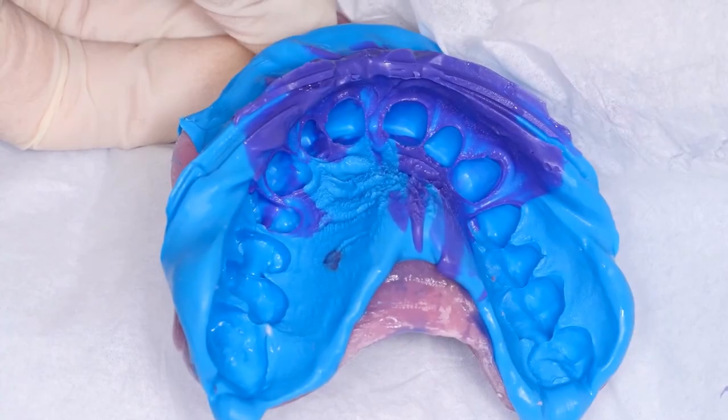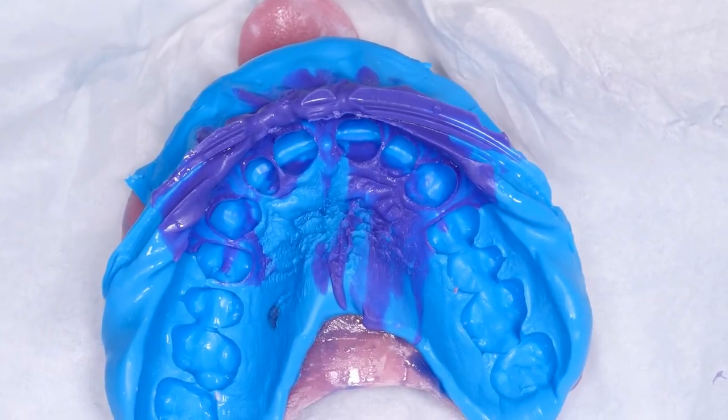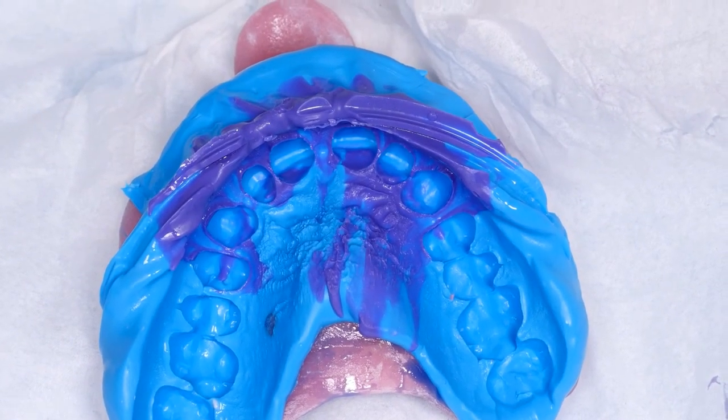Dr. Fredani, can you see the buckle? Maybe with the color, you see a bit less, you see. Okay, let's remove the cords and let him rinse his mouth.